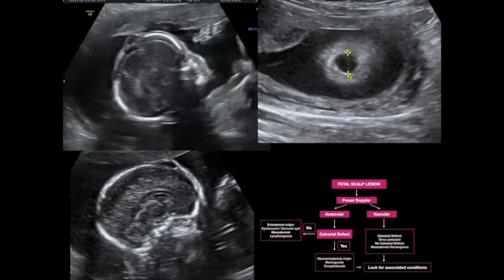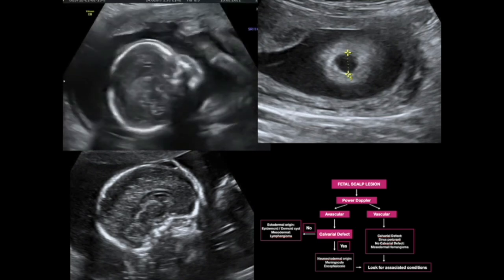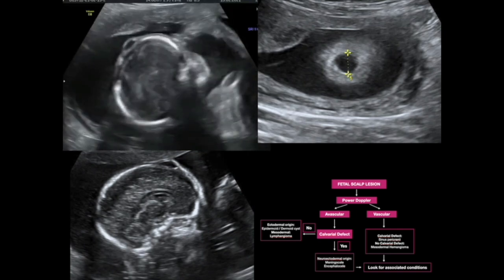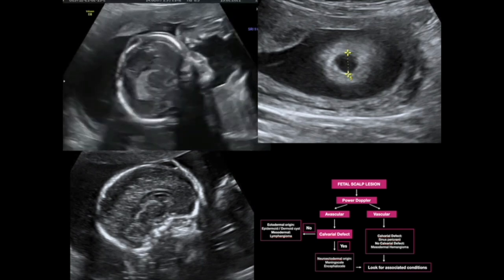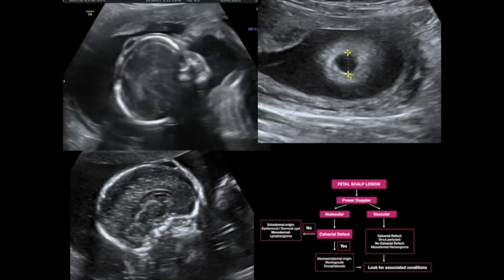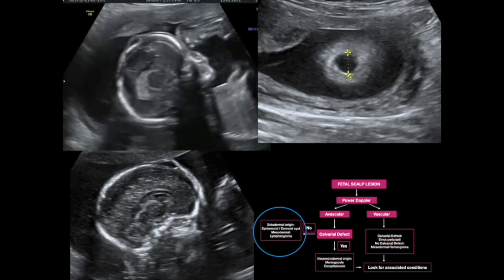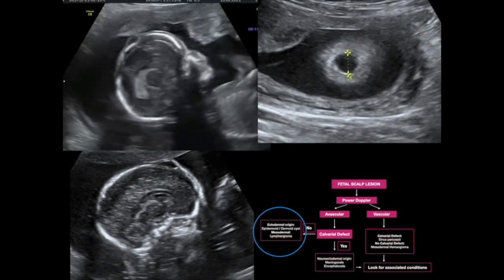Extracranial fetal masses are findings of major diagnostic alarm, of which encephalocele is the primary consideration. With Doppler ultrasound, no tissue or vascularity were found in this lesion. No abnormal or communicating blood vessels were seen under the lesion on power Doppler. If you look at our flowchart, the diagnostic algorithm is directed towards cystic scalp masses of ectodermal origin.